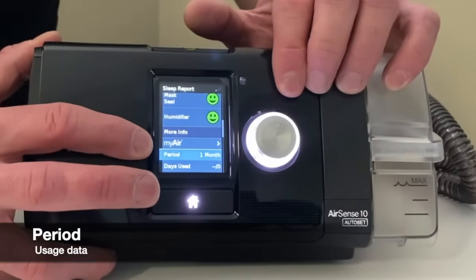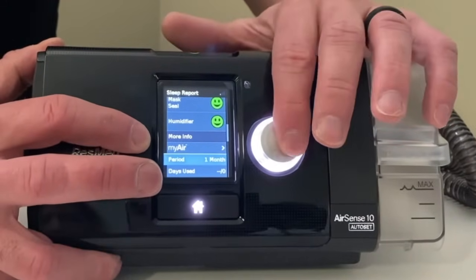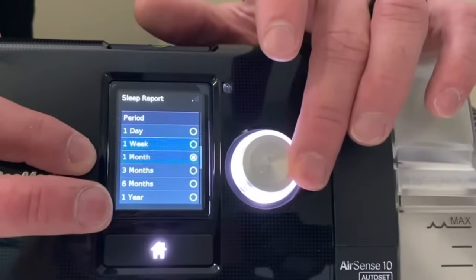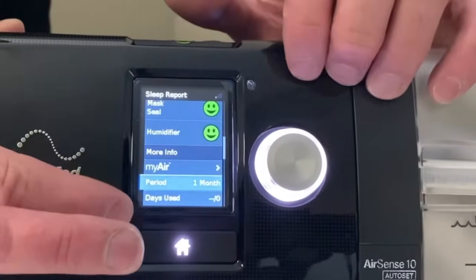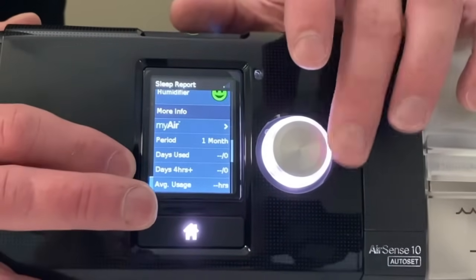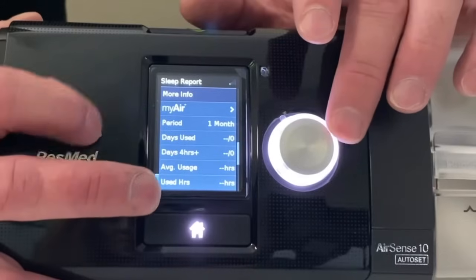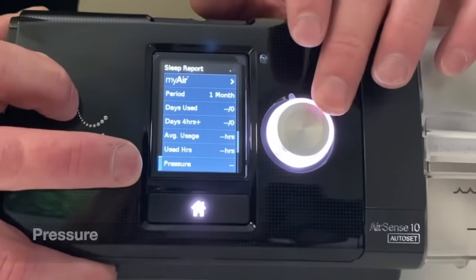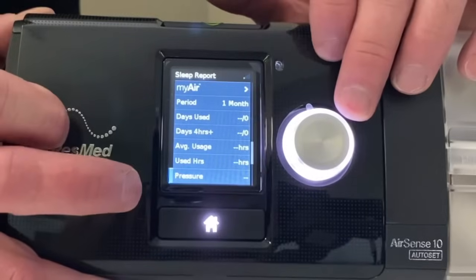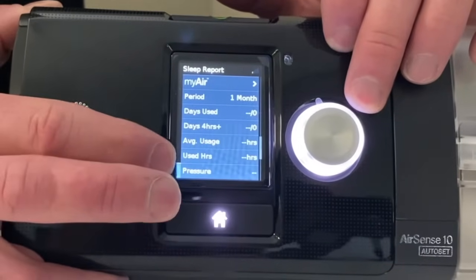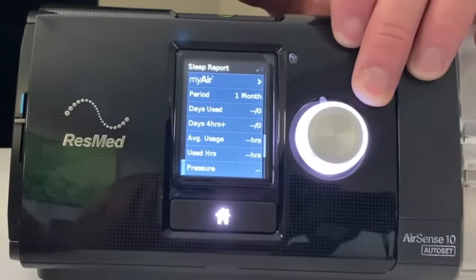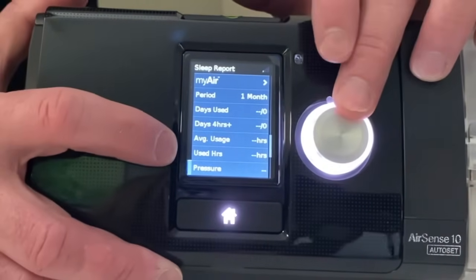The next piece here is a period setting, and you can change this if you click on it. You've got anywhere from a day to a year, and this is going to give you a bunch of different clinical data below. As we scroll down, you'll see usage data — this will help with your usage and your compliance for insurance. We can also see the pressure; right now I've got this set from 6 to 16, and this gives us the 95th percentile pressure, so if you're on an auto set, that can vary.